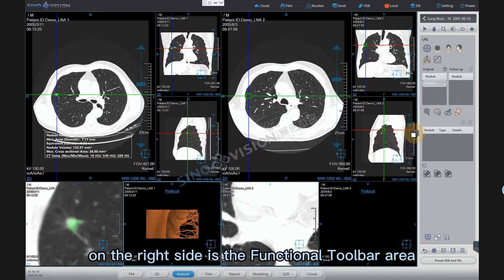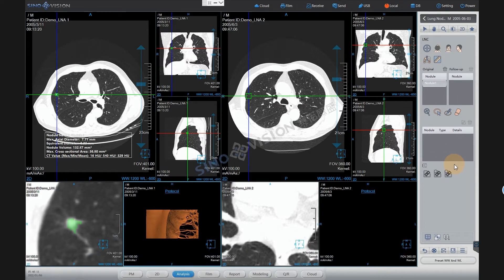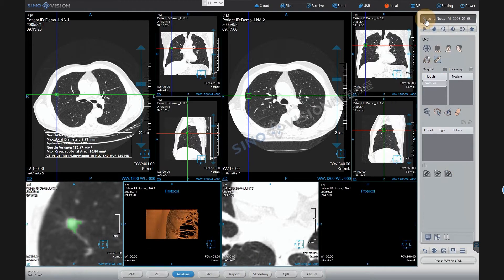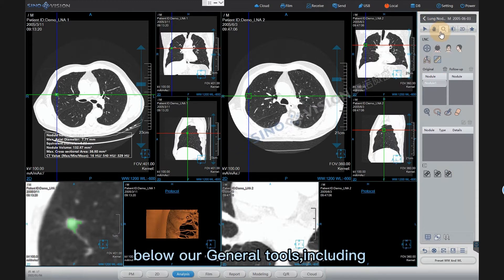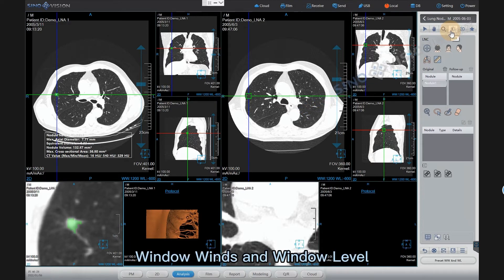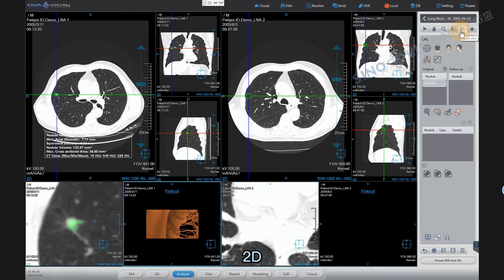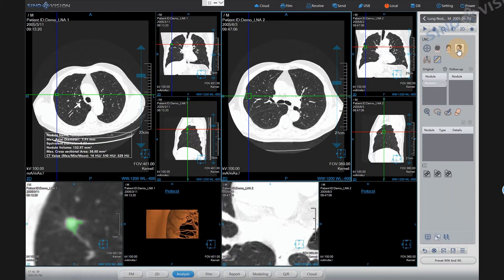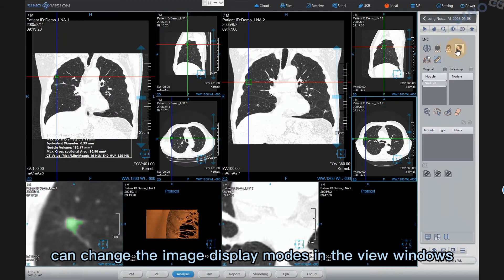On the right side is the functional toolbar area. Patient information is displayed at the top. Below are general tools including: Default, Pan, Zoom, Window Width and Window Level, 2D, and Bookmark. The axial, coronal, and sagittal icons displayed below can change the image display modes in the view windows.